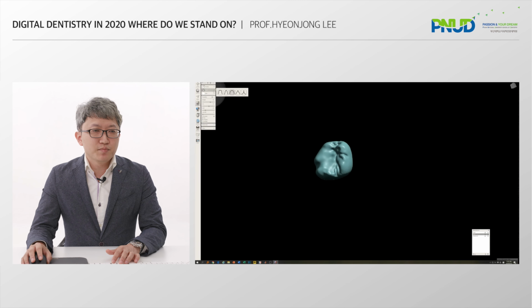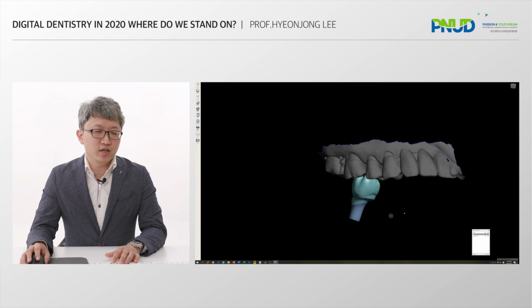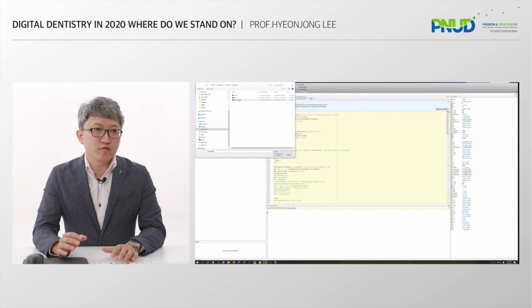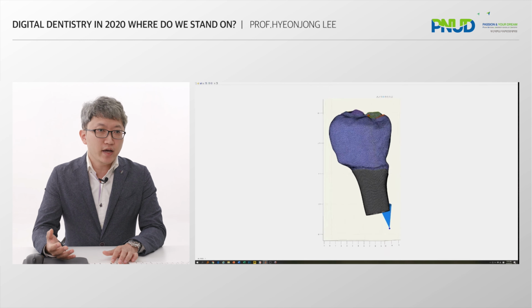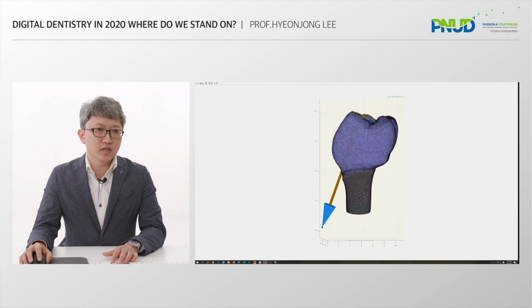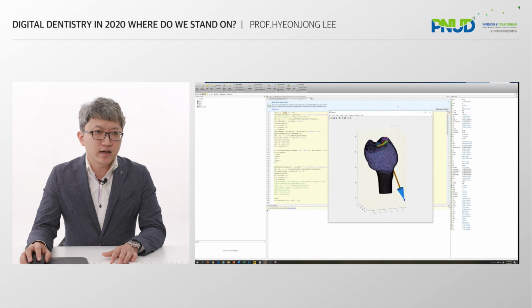So we can export 3D XYZ data and vector data from this 3D data. This means that after we finish the occlusal design in dental CAD software such as ExoCAD, we may calculate the mean vector from the multiple occlusal contact points automatically. And we already know the 3D position of the implant platform from this CAD-CAM abutment data.